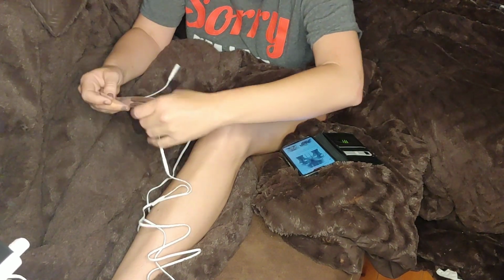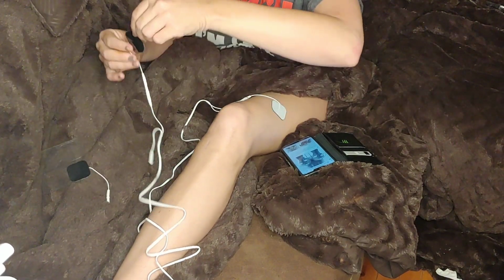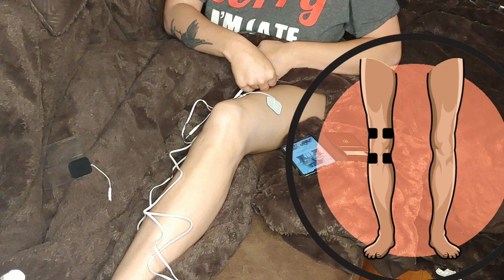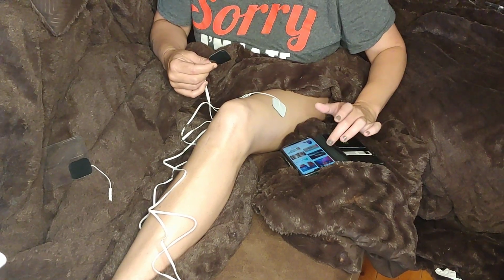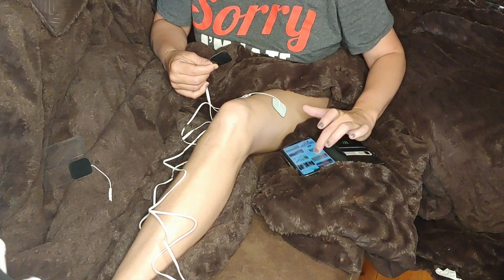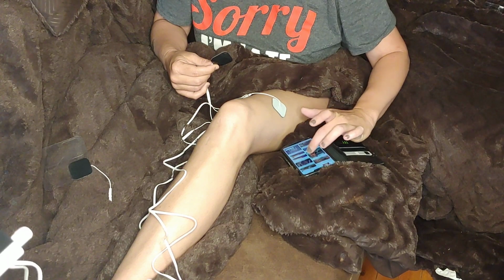She has found the placements on Google. Now, our attempt is to get the quad to fire. I thought we were going to try to use it for pain reduction. Maybe we'll try that later. Right now, she wants the quad to fire, and she thinks by firing the quad she can hopefully take away some of her symptoms of pain, the swelling and pain of her knee, by having the quad muscle take up some of the load when she walks.